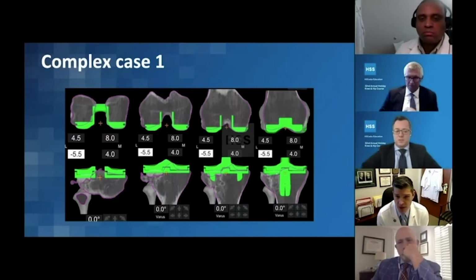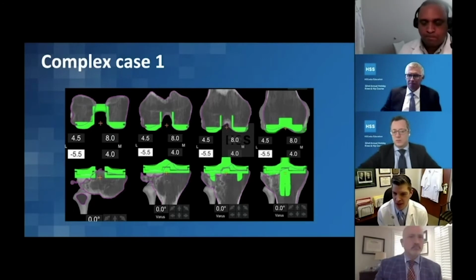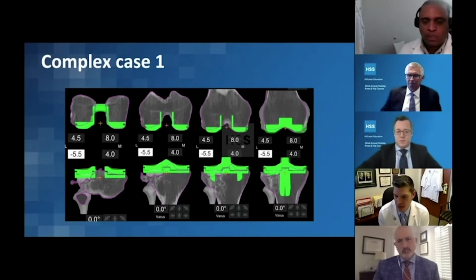Oftentimes these patients are, number one, they're stiff. It's interesting from a balancing perspective. Sometimes these actually aren't as hard to balance because they haven't been valgus their whole life, and they haven't gotten that scarred lateral side and that loose medial side. So sometimes because it's mainly just a bony defect, they balance out pretty easily.